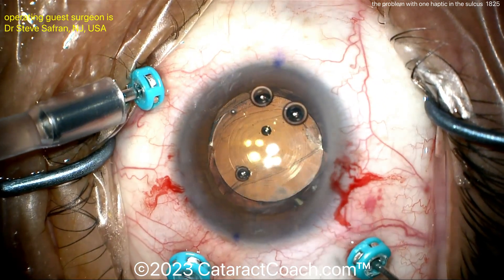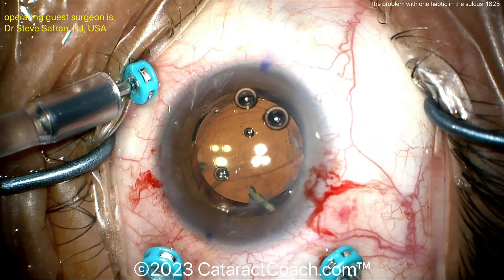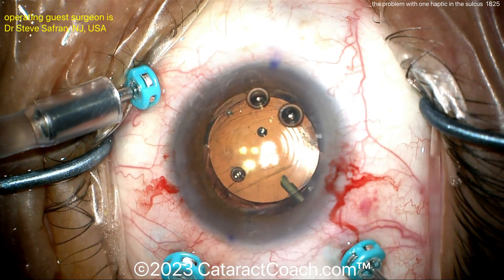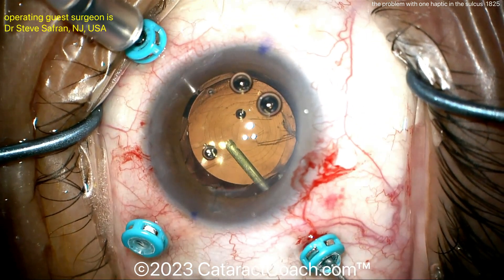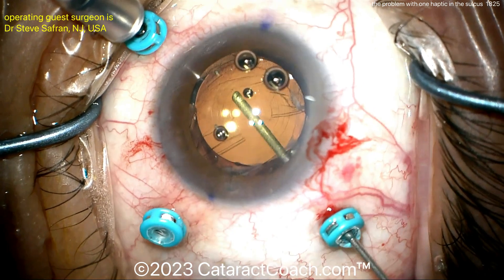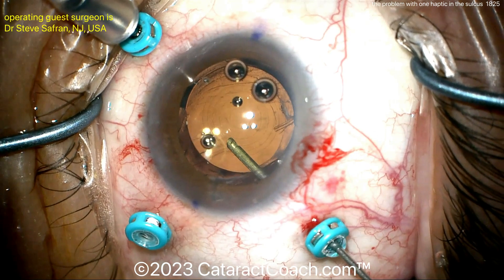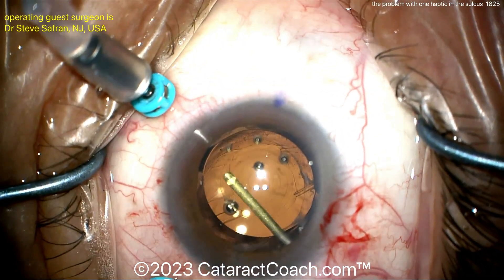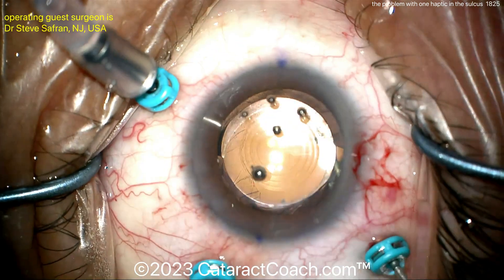Anterior vitrectomy is being done here because there is prolapsed vitreous around that break in the posterior capsule. So now this is looking a lot better. Anterior vitrectomy — cleaning that up, also taking away a little bit of that central capsule. Those wrinkles — you don't need those in the central visual axis, and they're not providing much support for the IOL either.